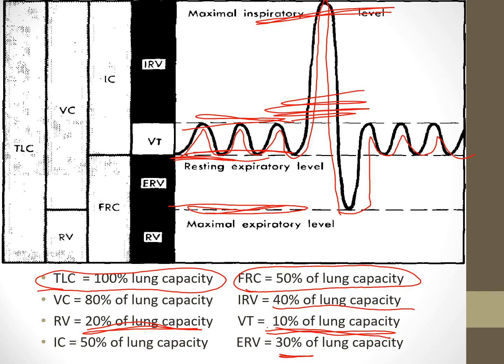Now there's a 4th way in theory where they could do it from an X-ray or CT scan. I won't question you on that here, but there's 3 primary ways we can measure someone's total lung capacity: body box, so body plethysmography; nitrogen washout, where they breathe in 100% oxygen; and helium dilution, and you'll read about these in your book as well. So those are the 3 primary ways that we can do this.